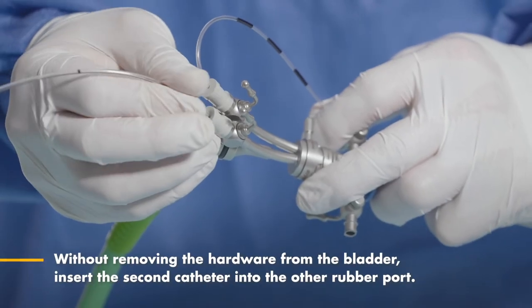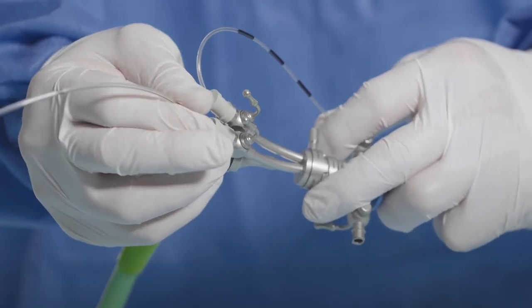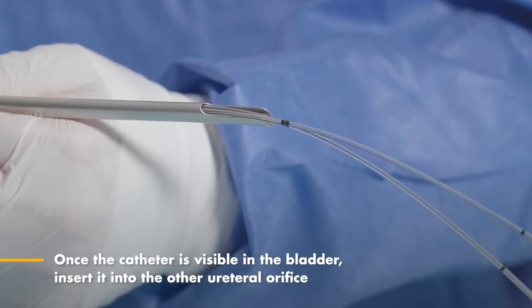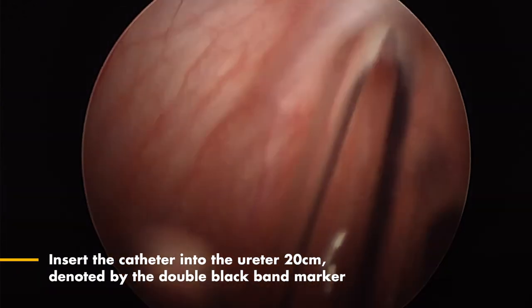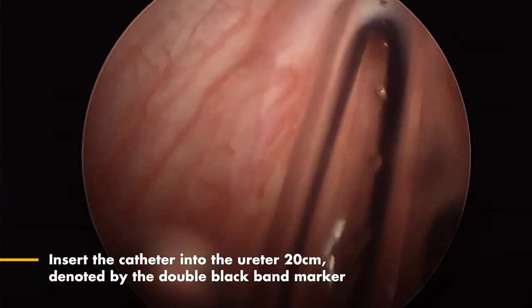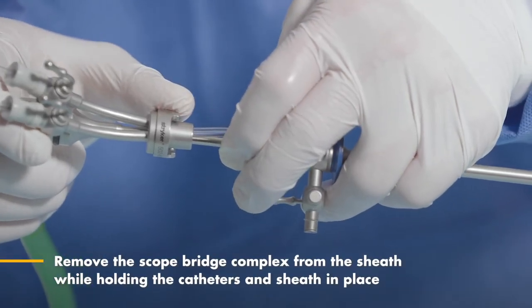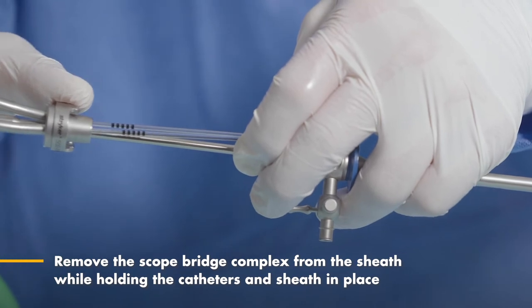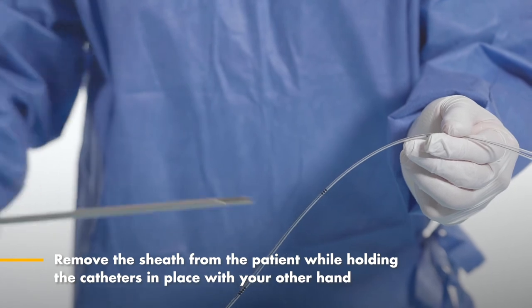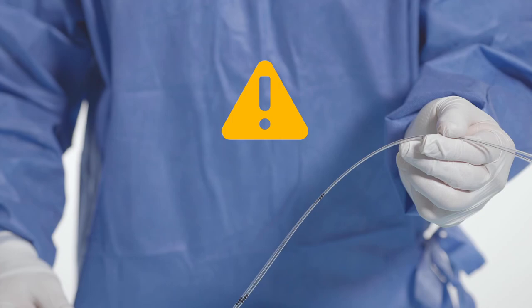Without removing the hardware from the bladder, insert the second catheter into the other rubber port of the bridge. Once the catheter is visible in the bladder, insert it into the other ureteral orifice and advance 20 centimeters, again denoted by the double black bands marked on the catheter. Next, remove the scope-bridge complex from the sheath while holding the catheters and sheath in place. Finally, remove the sheath from the patient while holding the catheters in place with your other hand. Be cautious when removing the hardware to not accidentally pull out the catheters.